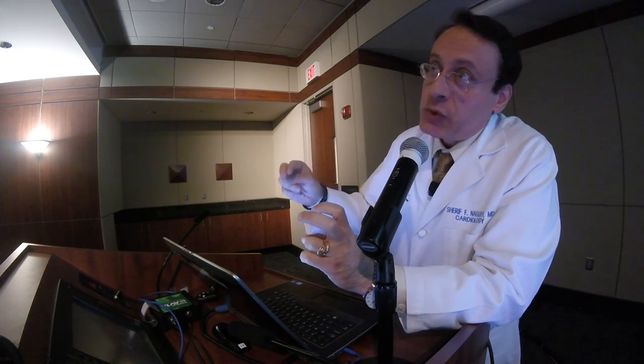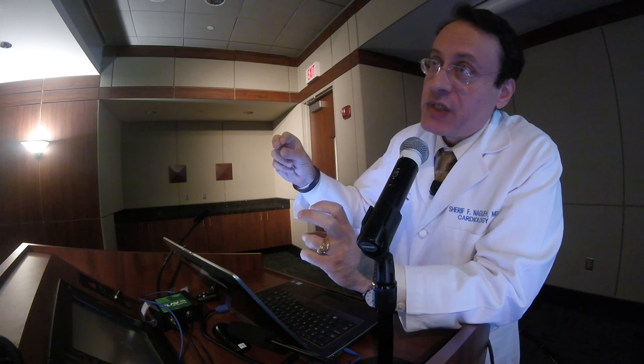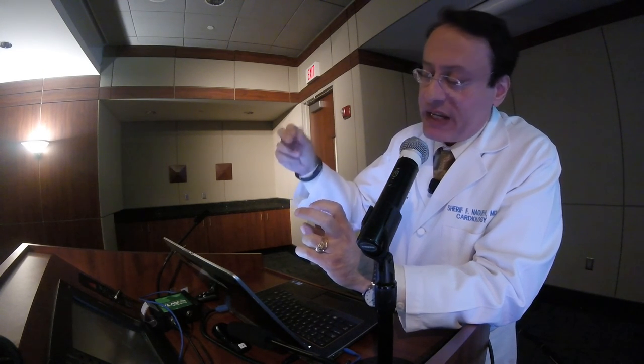what you have on these guidelines, sort of these extremes again, is okay. You will see situations where you have a ratio that is less than one. This is the tricky part of using a ratio less than one, but the absolute E velocity is not reduced to something like 80 or 90. And now these patients may have an elevated LAP, hence the subset where you want additional information.